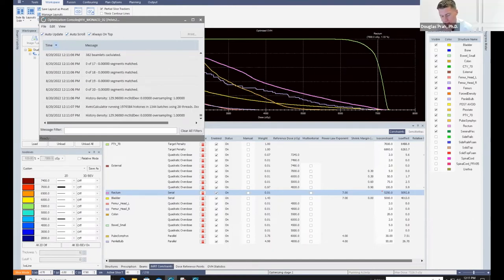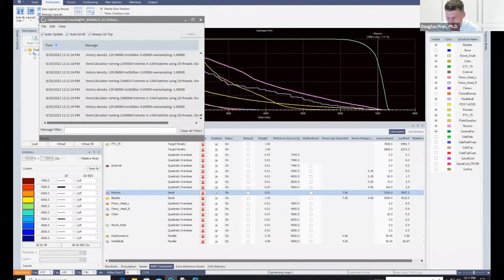Sure. I recommend you be careful. There are several different conformality indexes. There are the more common ones, but then there are some that only look at the volume that's inside of the isodose line, and some that exclude the volume. So just make sure that the definition they have is the same as the definition you have, because you will see differences in the conformality indexes.